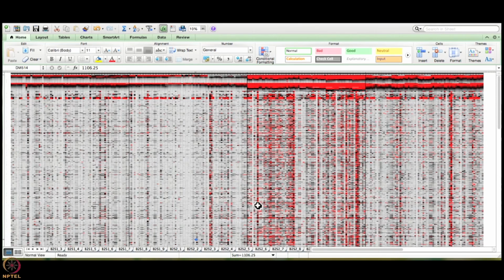So that is going to screw up your results a little later, because all the patients in this batch are going to show high signals, which is not correct. So this IgG mix printed on this chip is going to basically help you in deciding whether you need to rescan your slides at different PMT settings and power settings, right?